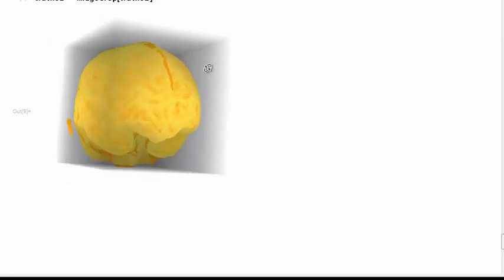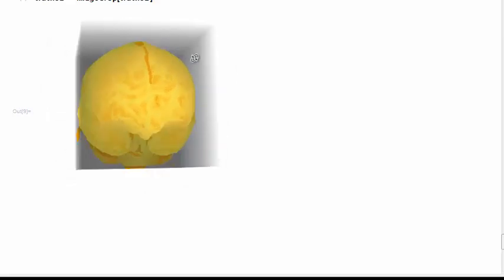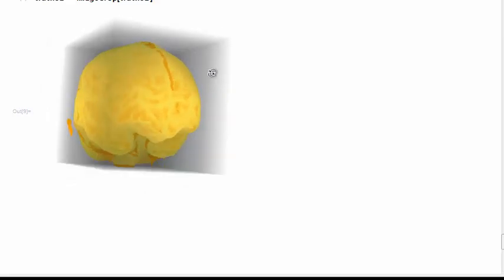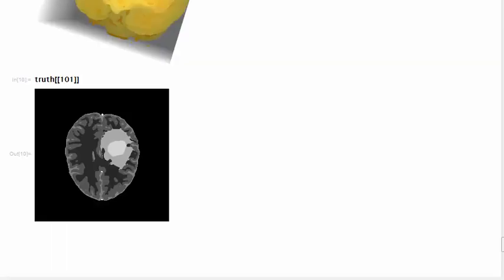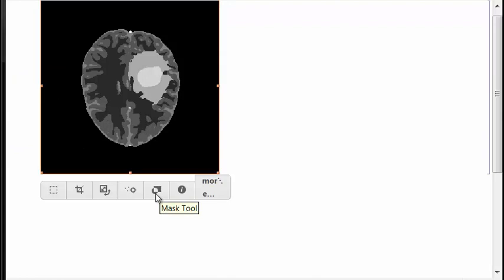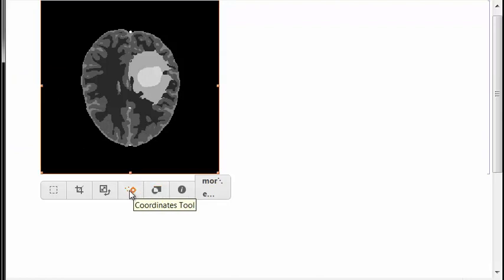I want to show you the relative position of the tumor and edema inside the brain. And for that, we need to assign transparency and color to the tumor and edema voxels. As I mentioned earlier, in the truth dataset all tumor voxels share a label as a gray level, and the same thing happens with the edema voxels. We're going to find out what these gray levels are in order to assign transparency and color to the tumor and edema inside the brain.